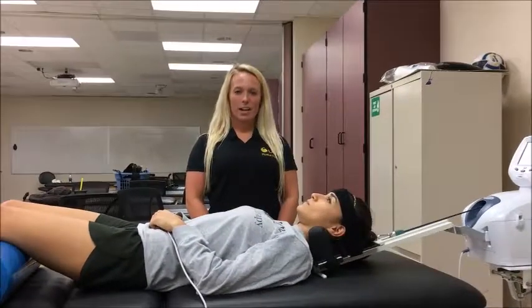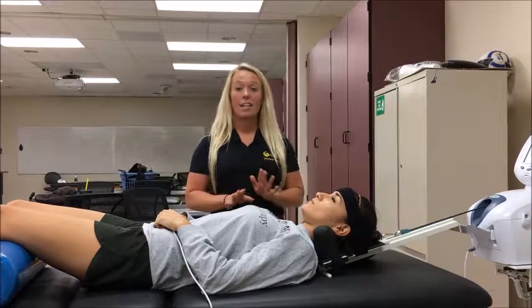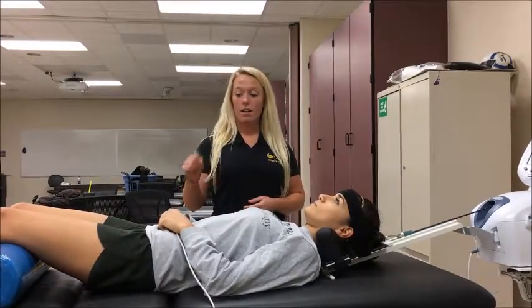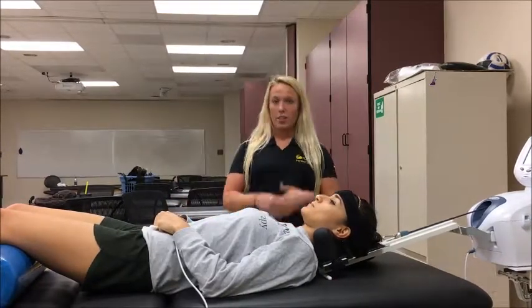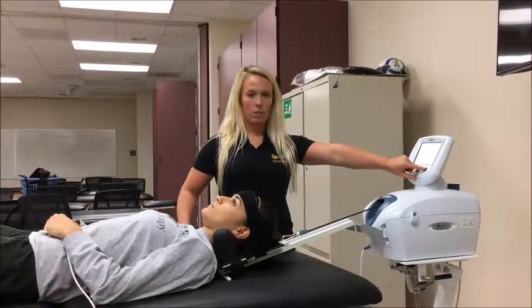After the parameters have been set, explain to your patient that they will have a feeling of pulling in the neck, and if at any time they feel pain or peripheralization of symptoms, they can press that emergency button and the machine will immediately stop. So now we're going to start treatment. In order to start treatment, you just have to press the start button on the machine.